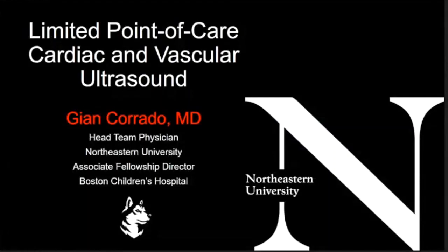About how you get the images, how you use the probe, some tricks of the trade, some of the images you should be looking for. Again, today's mostly about normals, and that's where you're going to start. Just like we started with a normal heart, and we've learned how to identify a normal aorta, and we're learning how to identify abnormal structures in the heart. You'll learn as you use it, and so today is certainly about normal.